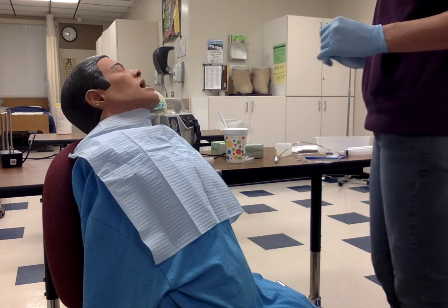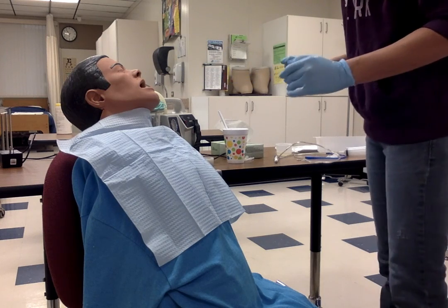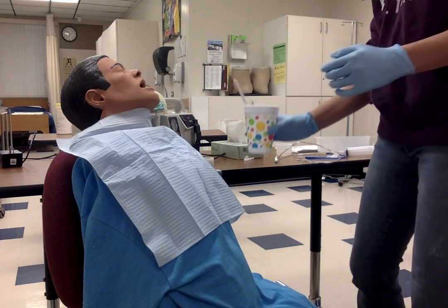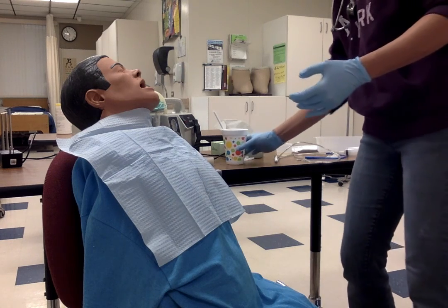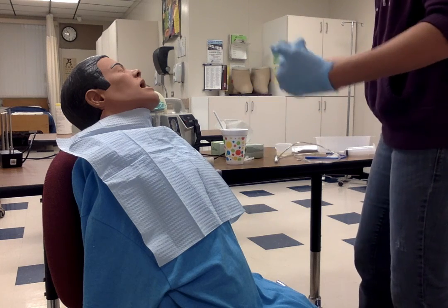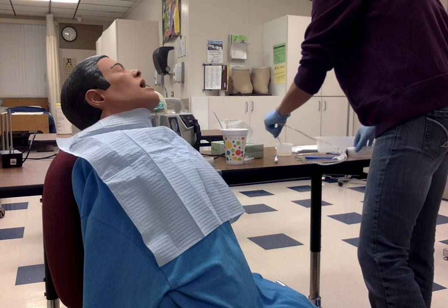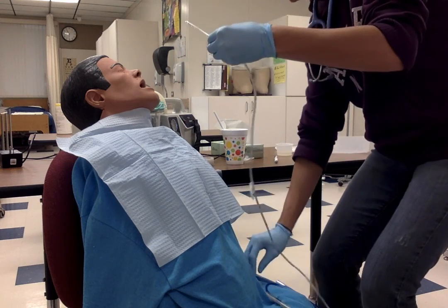So now that we have assessed the nose, we're going to use the right nostril. The patient's agreeable, ready to go. I have a cup of water. I'm going to give this to you, and I'm going to have you hold this. And when I tell you to drink, we'll have you drink, drink, drink, okay? So we're going to say that the patient is holding the cup of water and is able to drink on their own. All right, so. Okay, I have this ready here. I'm going to put this down here.